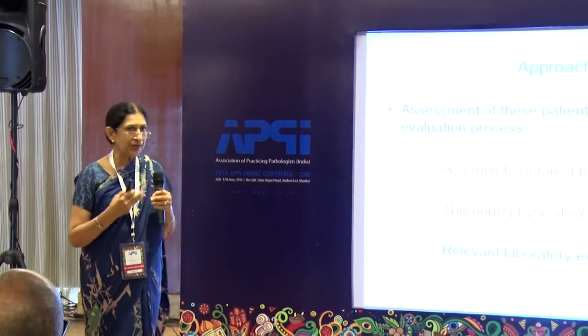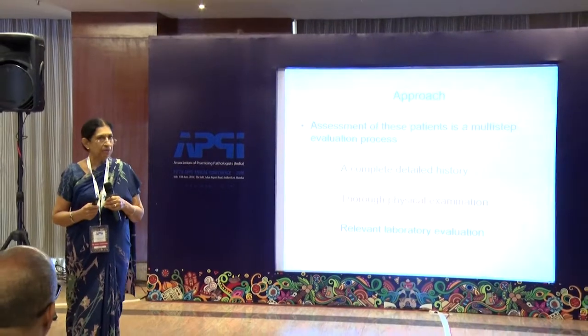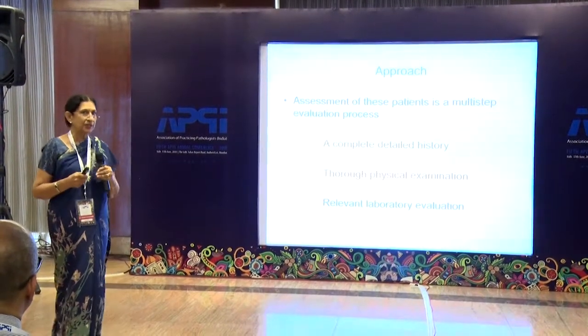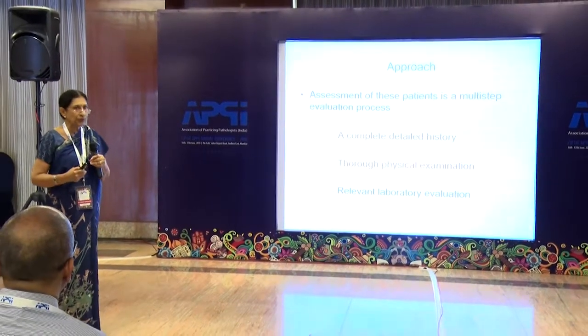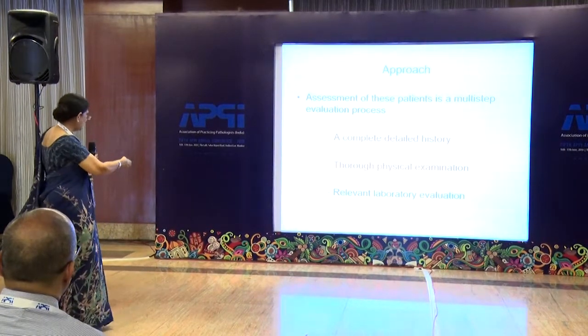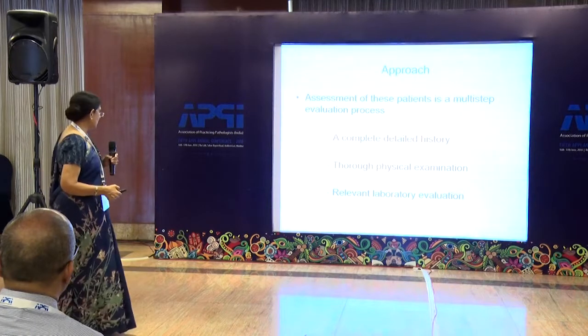Unfortunately, the first two are never given to us when we are sitting in the lab. And that's why we have to pay attention to our patient when the patient comes there. Request that the patient should come to you for drawing of the blood sample so that you can plan the last, which is the relevant laboratory evaluation.